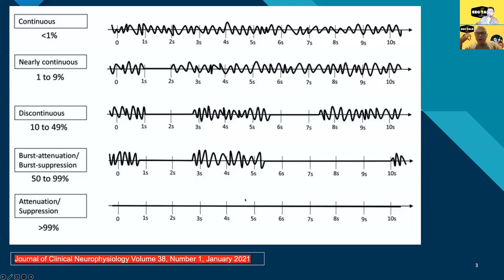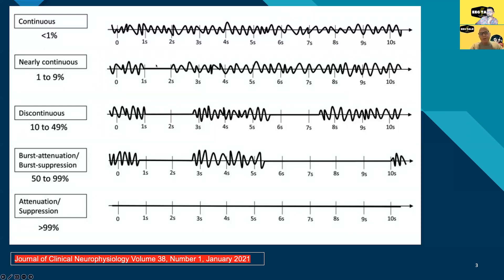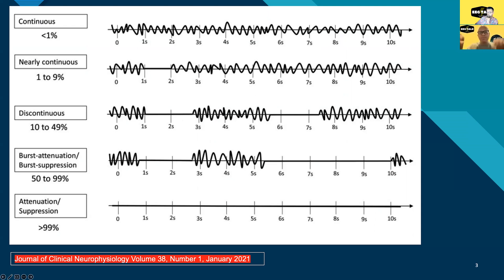We're also going to talk about burst suppression with epileptiform activity. Looking at the diagram, we have continuous EEG at the top, then nearly continuous with a brief intermittent suppression, then discontinuous — less than 50% of the time suppressed. Then we get into what's officially called burst suppression where it's flat — or burst attenuation if the reduction is at least 50% but not down to 10 microvolts — and complete suppression or attenuation at the bottom.